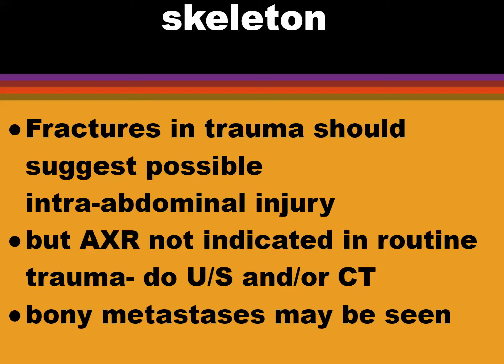Also look at the bones for bony metastases. They can be quite obvious, but you've got to be looking for them. And you don't really want to miss a cancer, particularly one that could be treated and survival might increase.